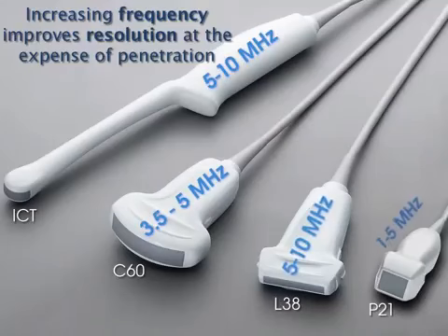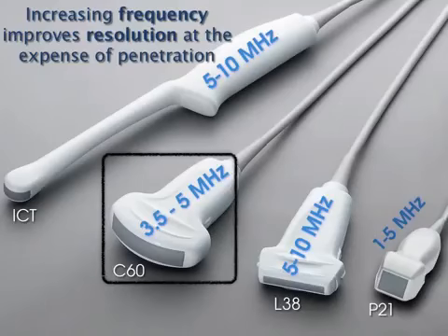So which transducer do we want to use to image the bladder? Well, keep in mind that when you increase the frequency, you get much better resolution at the expense of penetration. So when I want to look at somebody's bladder, usually it's in a distant location in the body. It's not right up against the skin line like the way our blood vasculature is. So we need to use a probe that can have a low enough frequency to penetrate down into the body, and that's when we can use either the C60 or the P21.